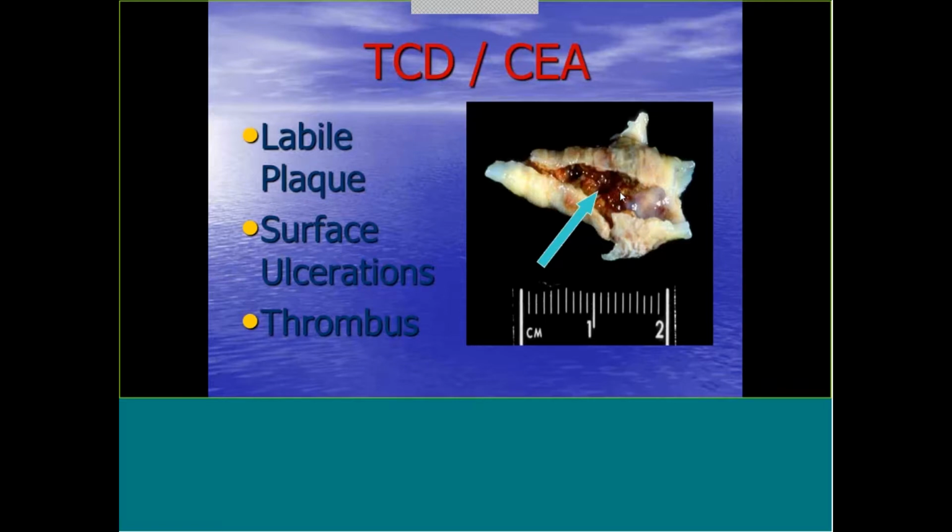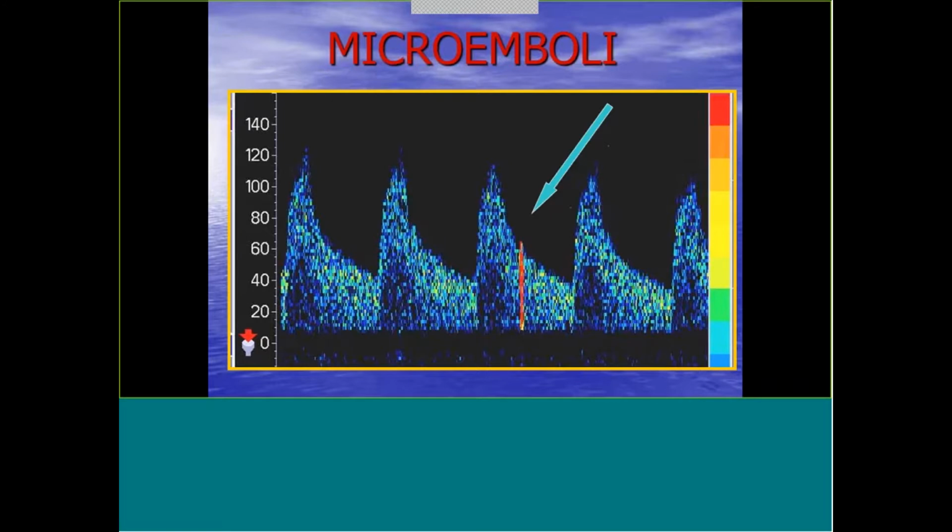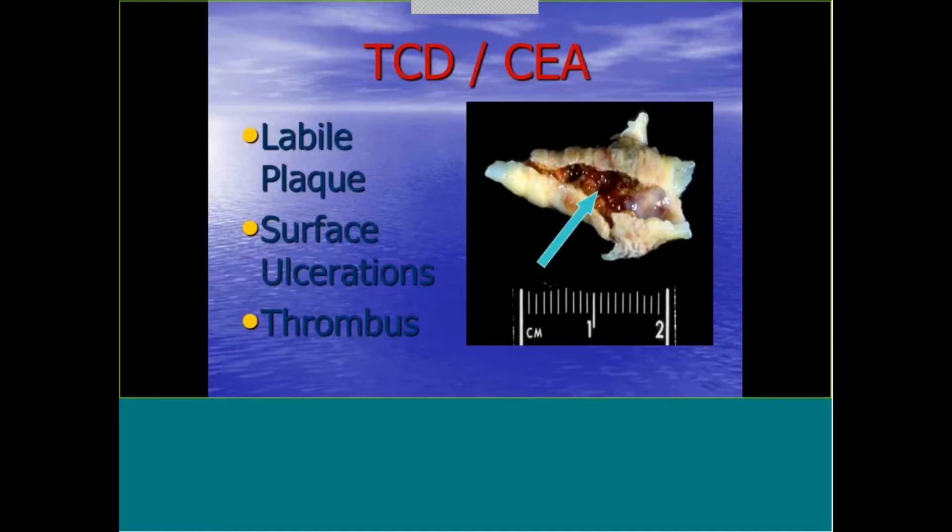So I always recommend for people, and you guys know what microemboli look like and sound like. This isn't a video of one, it's just a picture, not an audio of one. But I want to go back to this. When they're scrubbing the skin surface, you want to monitor these people, evaluate them in the holding area.